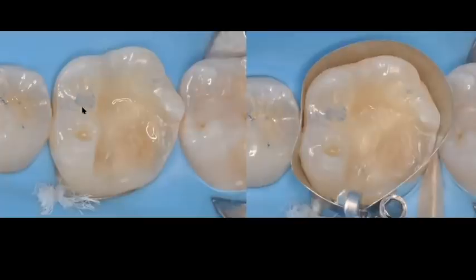Now, you can see here I have completely removed the previous restoration. You can see that this was a very, very deep preparation. So at this moment, I have to think about, okay, I'm working in deep dentin. The beauty of this is that I have a lot of enamel, and I know that bonding to that enamel is going to be great, but I have deep dentin, and I have to make sure that I adhere to that dentin in a special way.